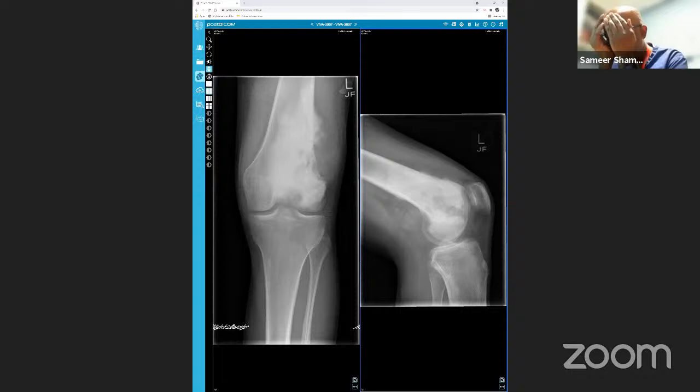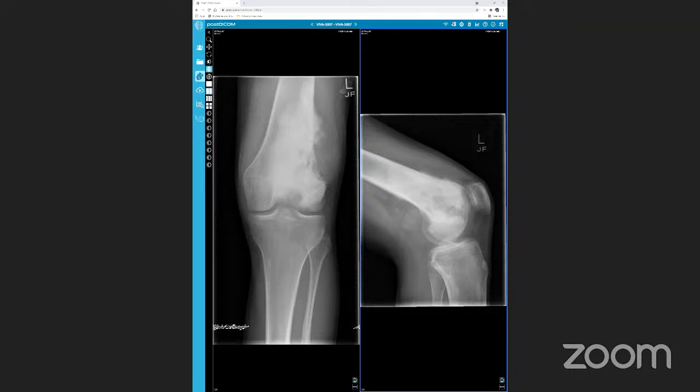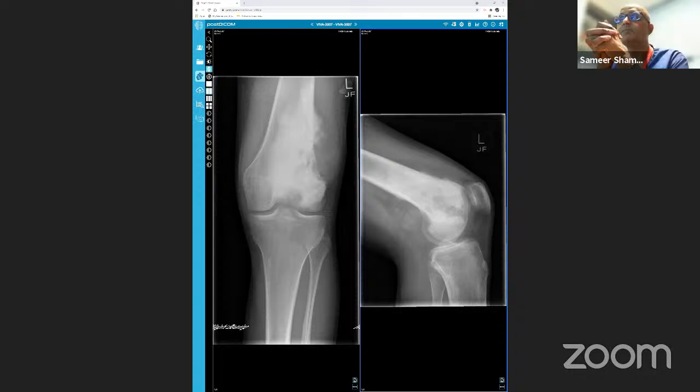This should be like your left upper lobe or left lower lobe collapse when you get a bone tumor. First and foremost, you would say which bone is affected, which part of the bone is affected, and then is it benign or malignant, and what is it causing? Like any other cancer, start locally and then move peripherally. So you did really well on this case.